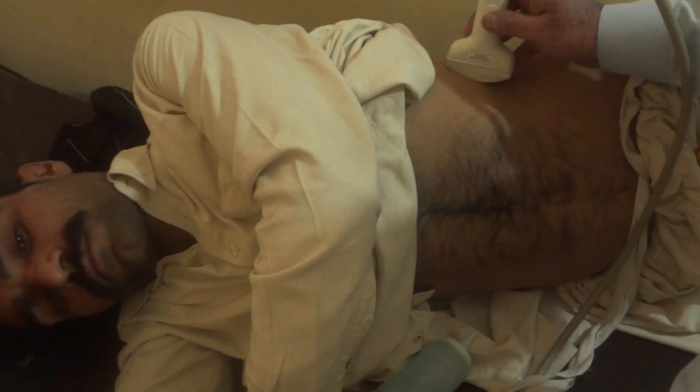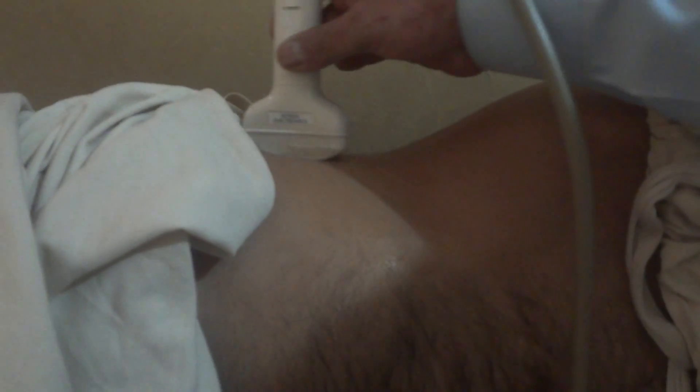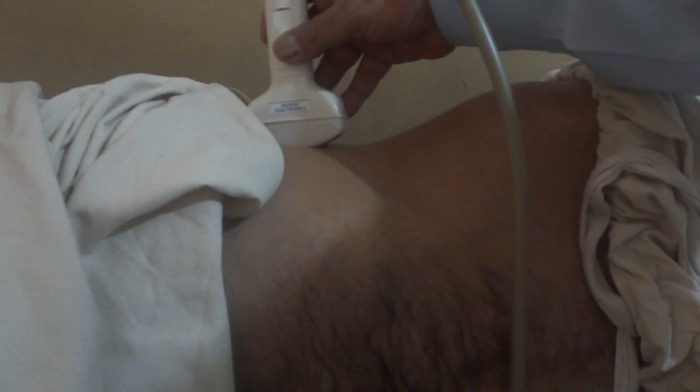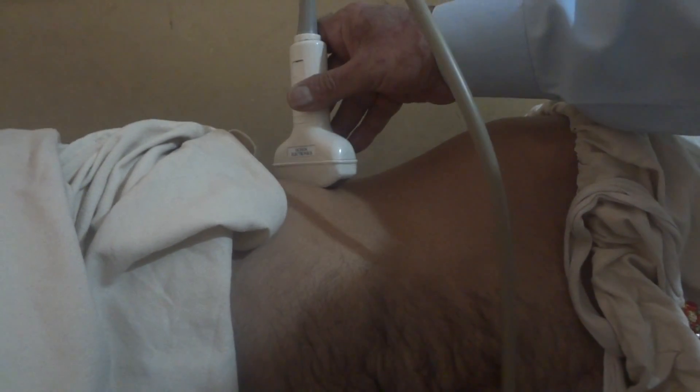This is a 30-year-old young man. I've asked him to lie in right lateral decubitus posture, and from this angle I am going to scan him. This is the intercostal space — I will be moving the probe in this region. This is the 11th intercostal space. This is the left costal margin, this is the 11th rib, and I will place the probe here to get the full kidney.